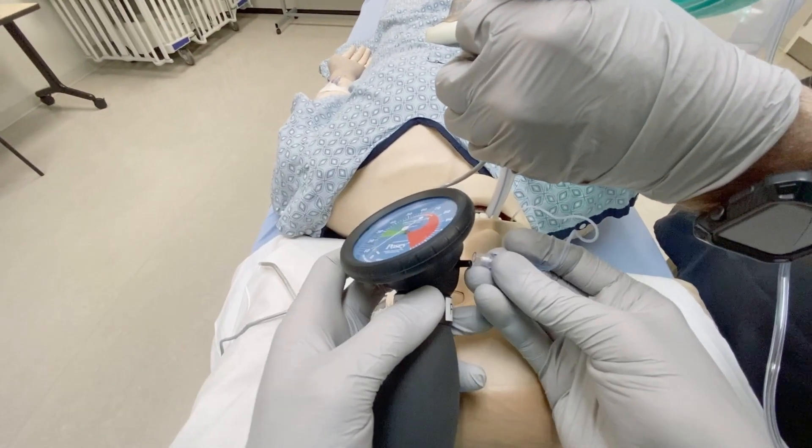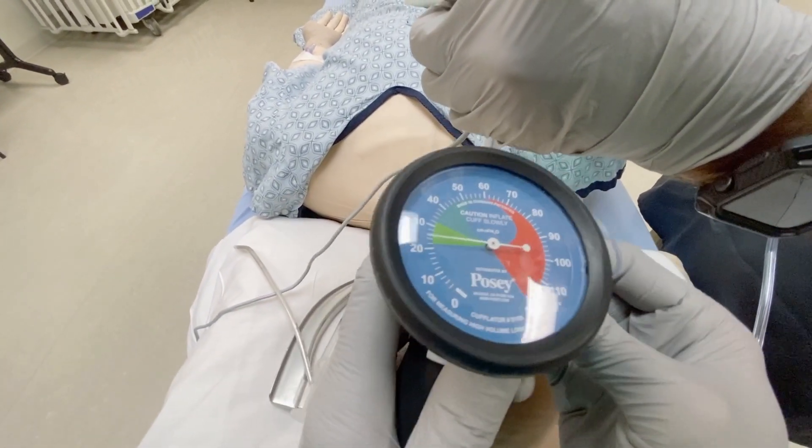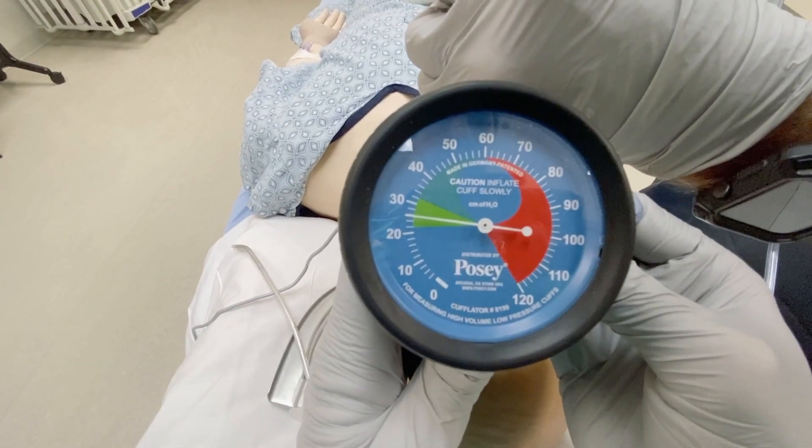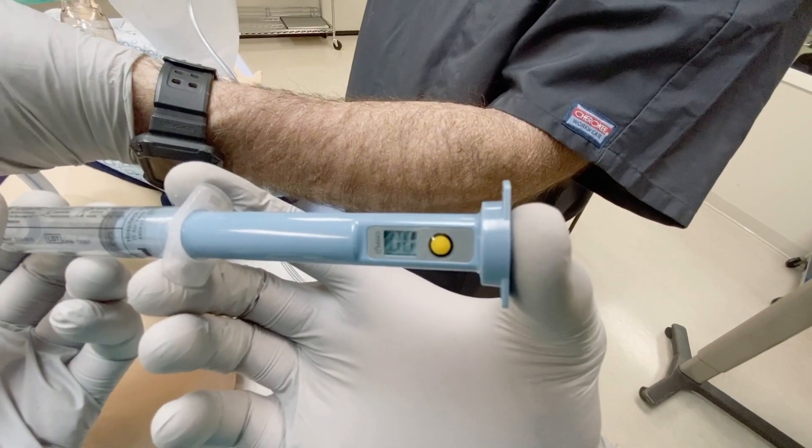We can check cuff pressure a couple of different ways. If you have a specialized pressure gauge, you can connect it right up to the pilot balloon. Or even better, you can use a pressure-sensing syringe to inflate the cuff.